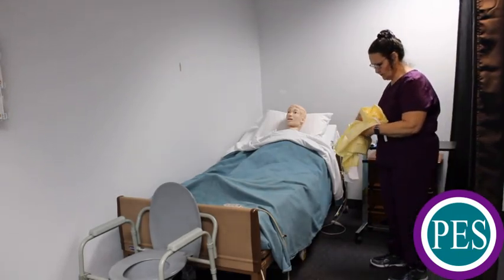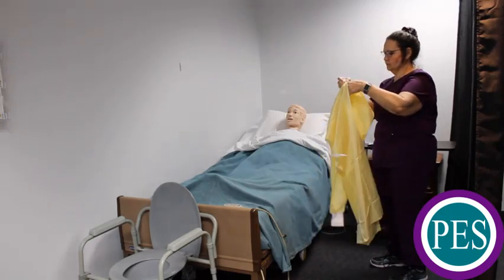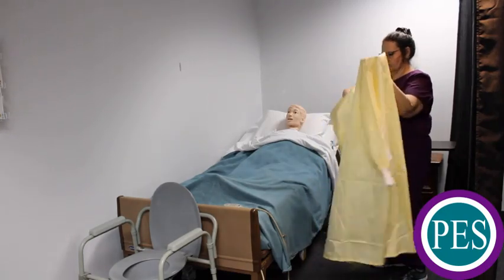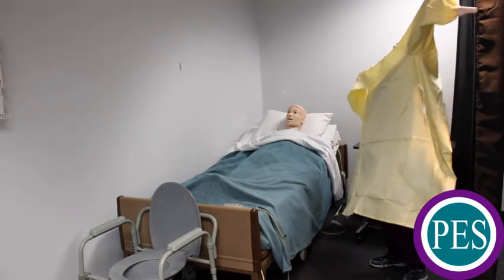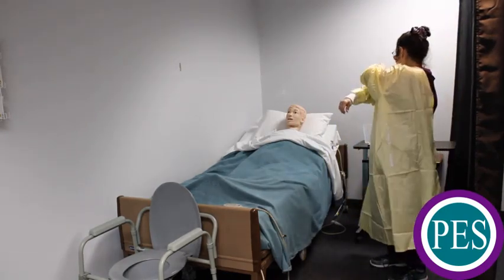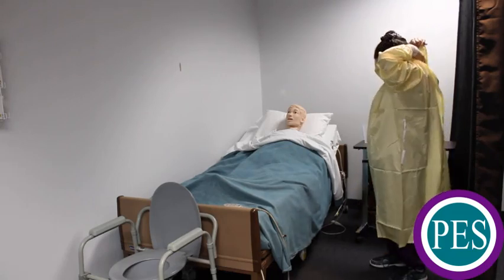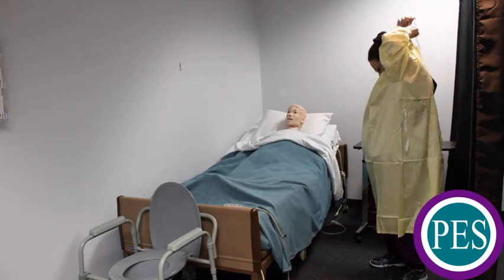Open and unfold the gown. Face the back opening of the gown. Place the arms through each sleeve. Secure the neck opening. Secure the gown at the waist, making sure that the back flaps cover the clothing as completely as possible.